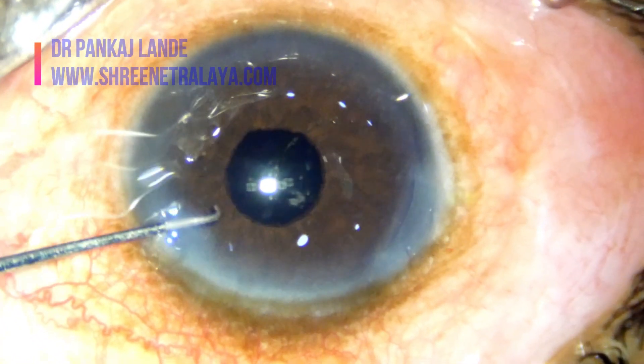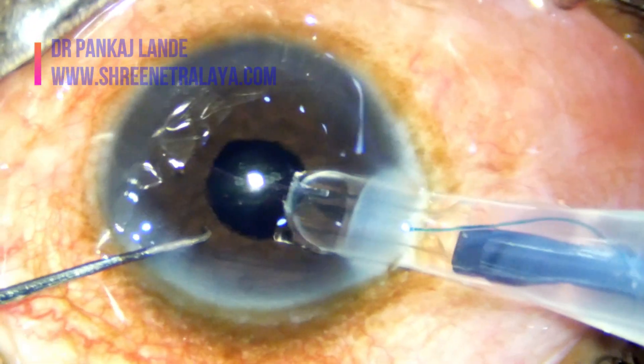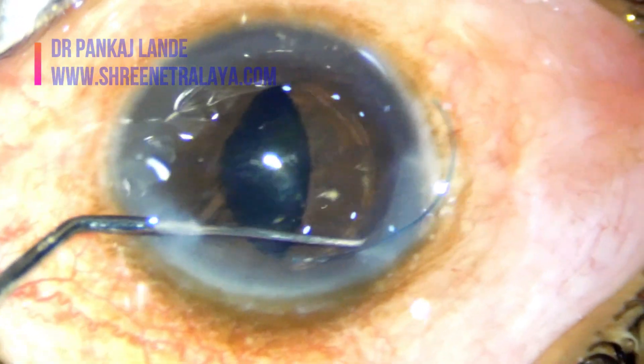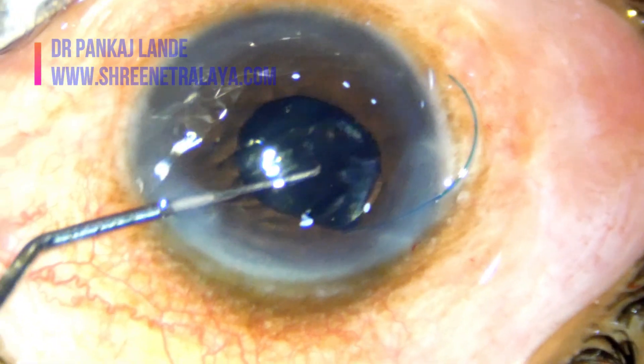I have implanted a three-piece foldable IOL. In these cases do not overfill the chamber. Also do not overhydrate the wounds as the fluid can track into the vitreous cavity and cause complications with IOL positioning.